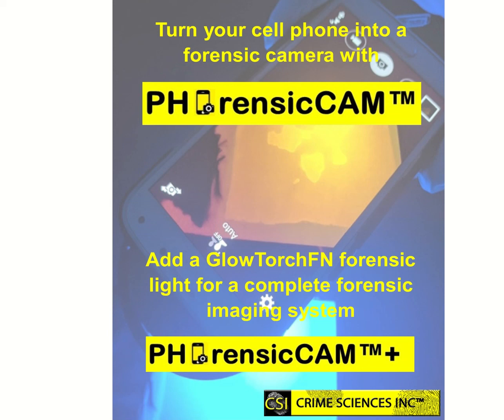Hi, this video will introduce you to the PhorensicCAM and PhorensicCAM Plus from Crime Sciences Inc. The PhorensicCAM allows you to transform any cell phone into a forensic imaging system with interchangeable camera filters and magnification lenses.